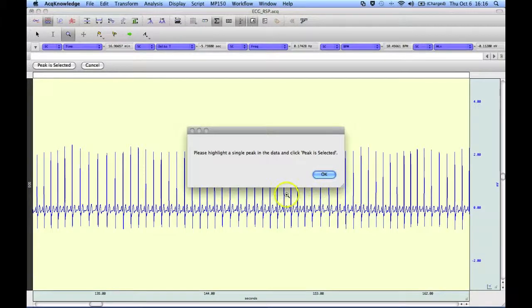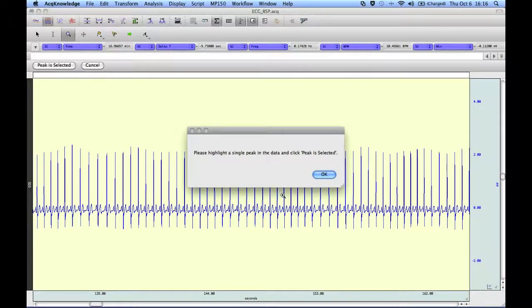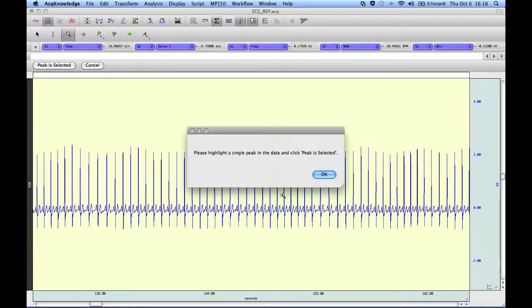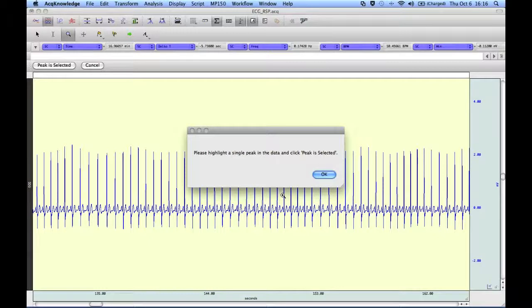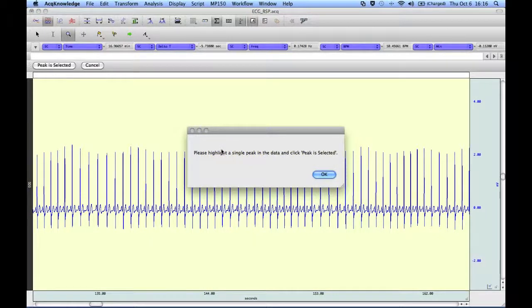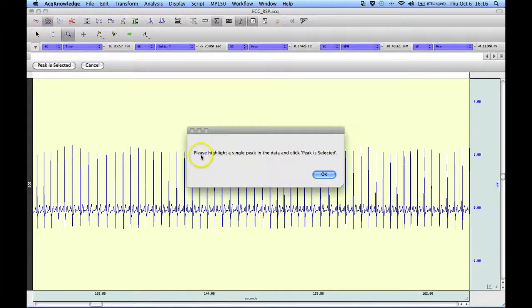The nice thing about this automated routine is it guides you through. The same can be done with the find peak cycle detector, but this automates the setup procedure for you.